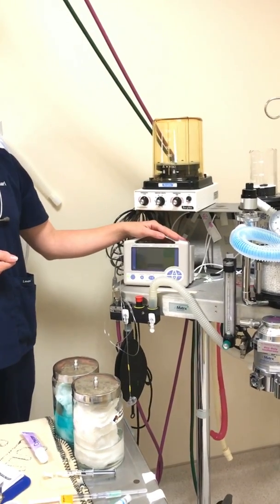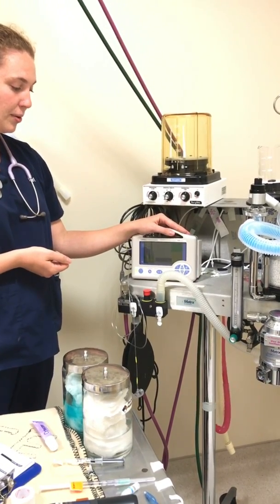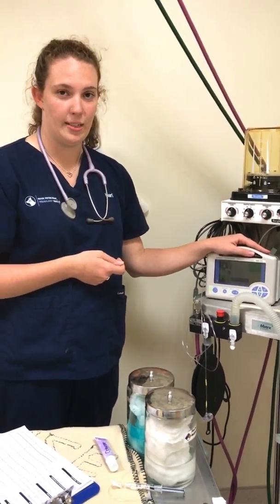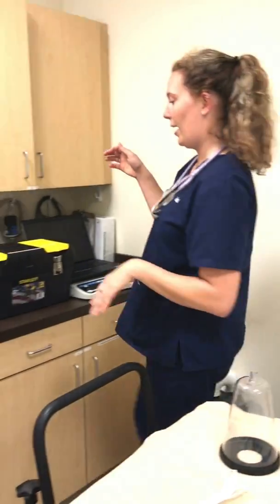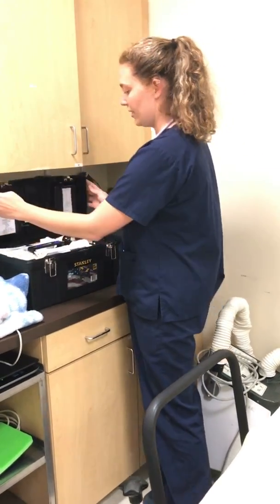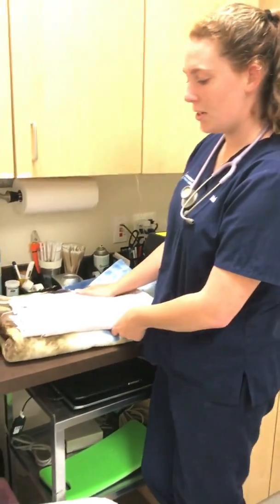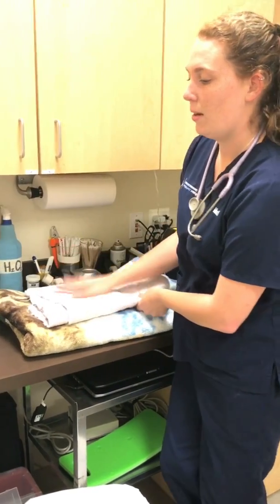Next, I've got our monitoring equipment, which is going to monitor her ECG, SpO2, end-tidal CO2, and blood pressure, as well as a stethoscope in case I need to manually listen to her heart. This has all been appropriately tested as well to make sure it is working properly prior to the procedure. We've got our crash box here, which contains all of our emergency drugs in case Kinsey were to experience cardiac or respiratory arrest during the procedure. We've got blankets here to use to keep Kinsey's body temperature at the appropriate degrees within the procedure.